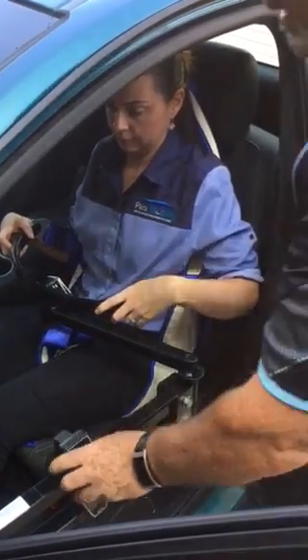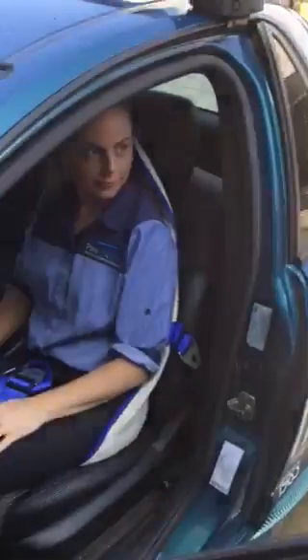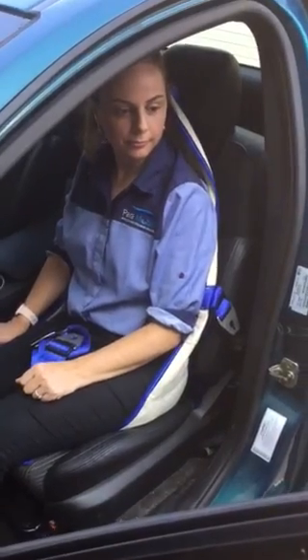Once at that position, I can then remove all the straps and Tanya's now in the seat, ready for us to dismantle the ibis. When it comes to removing Tanya out, we can simply bring the arm back across and hook up the sling.